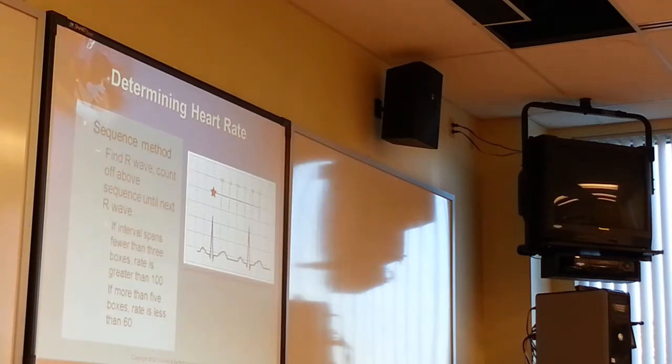This is the way I was taught. Taking the strip and looking at it, going from where the star is. Now you have to have it hit that solid red line. Okay? So there's the star. So you march it out: 300, 150, 100, 75, 60, 50.